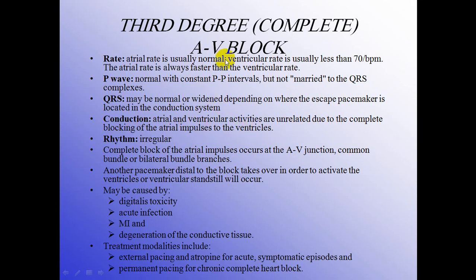In second degree AV block, not Wenckebach, there is a P wave, and one P wave is conducted. There is nothing conducted in the complete heart block.